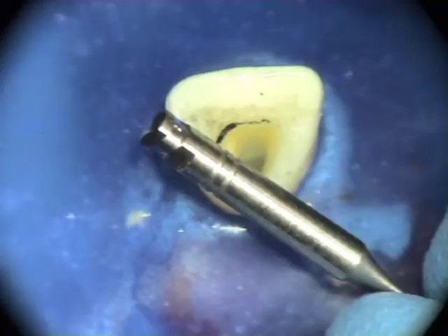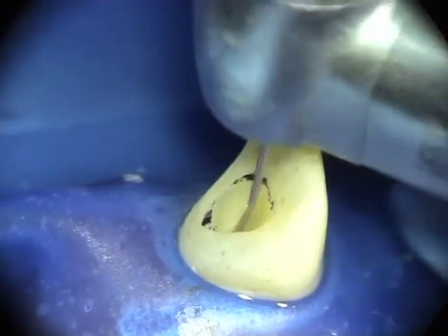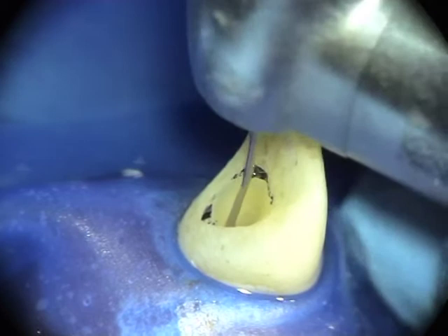A number 2 Gates-Glidden burr can now be selected and used to continue the flaring towards the root canal system.